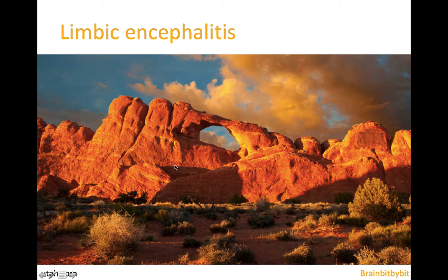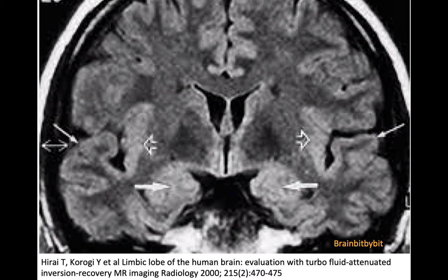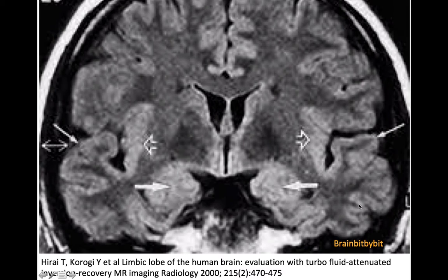The limbic system is not an anatomically defined network, but more of a functional concept involved in controlling emotion and memory. The structures always included are the cingulate gyrus, the amygdala, and the hippocampus. If you look closely at this coronal FLAIR image, these limbic structures have higher signal intensity than the neocortex, and the sub-insular cortex signal intensity is in between that of the hippocampus and neocortex.